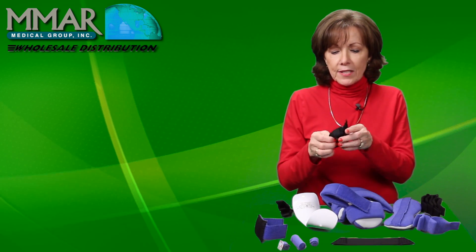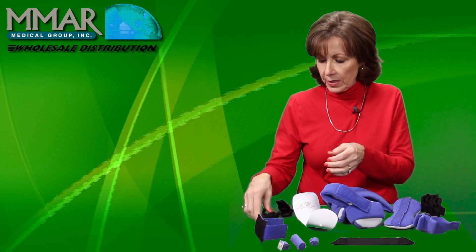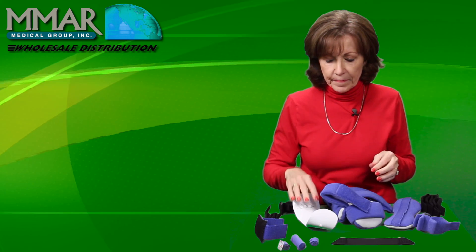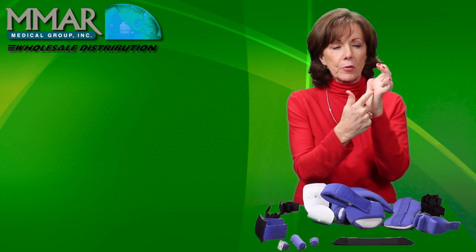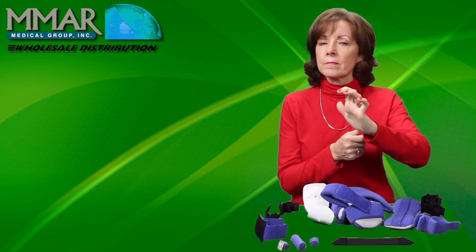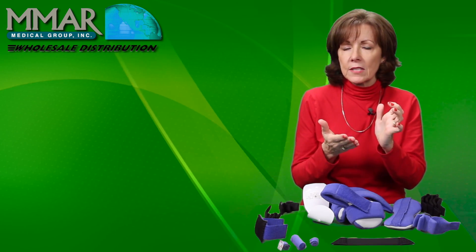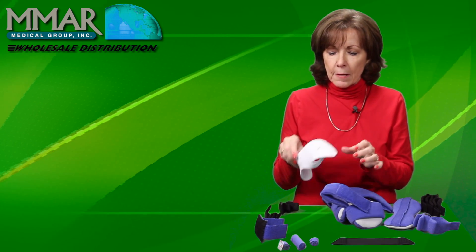These are ulnar drift finger separators for children, and this would be a regular finger separator for children. If you have hyperextended joints at the MCP — very common with cerebral palsy and other brain and spinal cord injury conditions — there is a component for that as well.